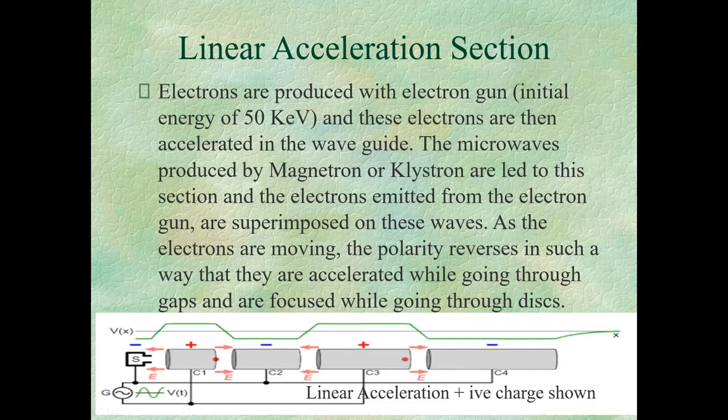This may be a familiar curve to you all. But when we remove this flattening filter, we get this peaked beam. It's kind of a peak. So in the center, we have more radiation, and towards the side, we have less radiation.